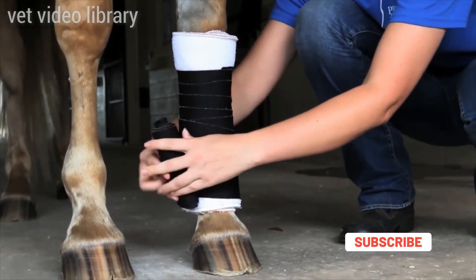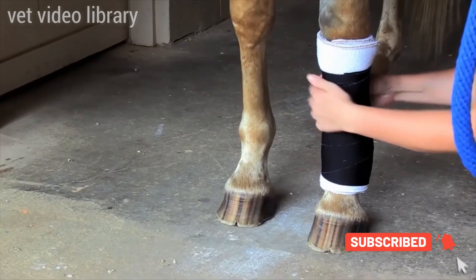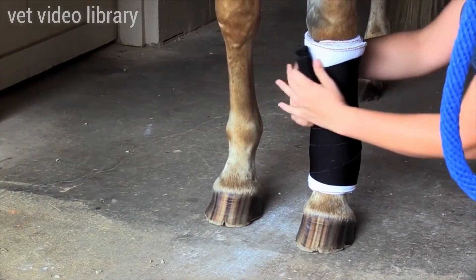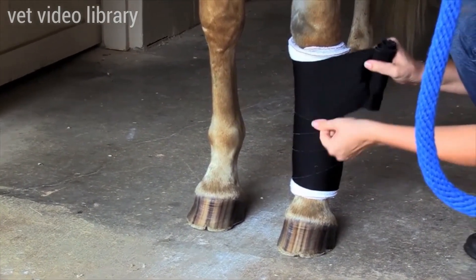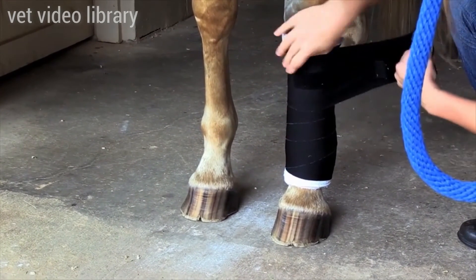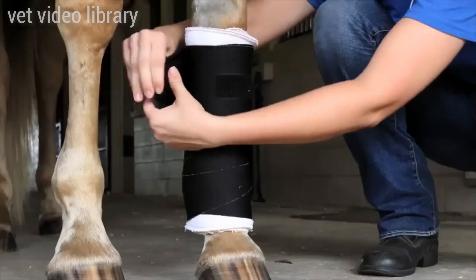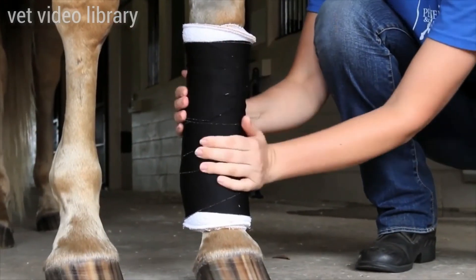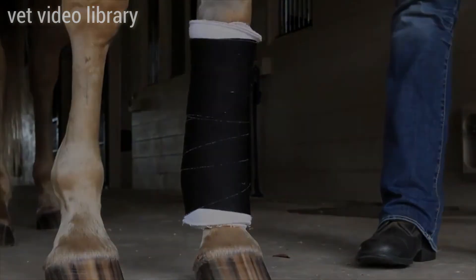She's going to take her felt down to the bottom of the fleece and then work her way back up the leg. You can see that the bandage is rolled flat, even to the leg, snug, even pressure. The Velcro bandage comes around the top and is reattached to itself.